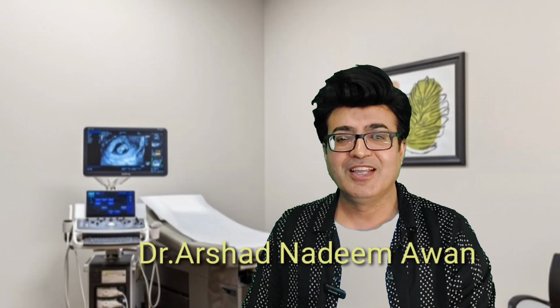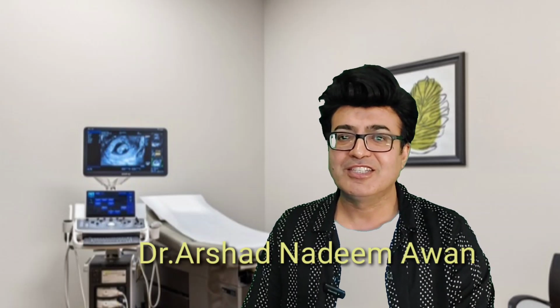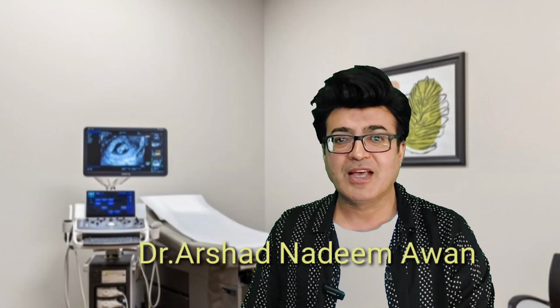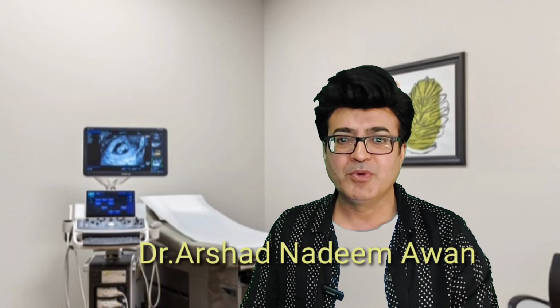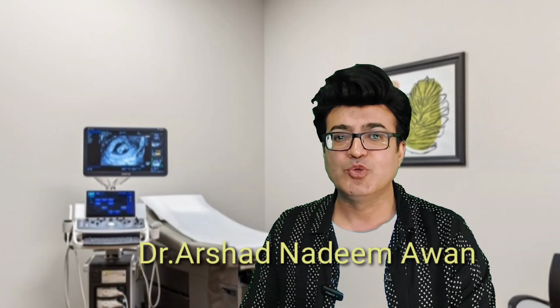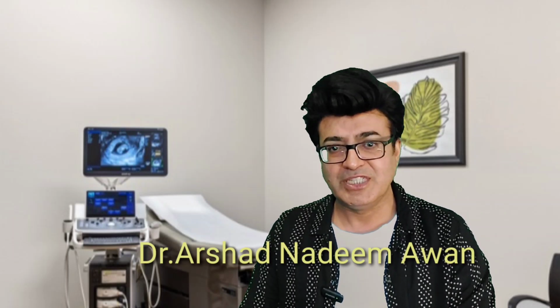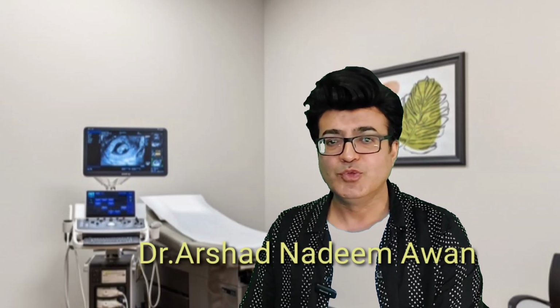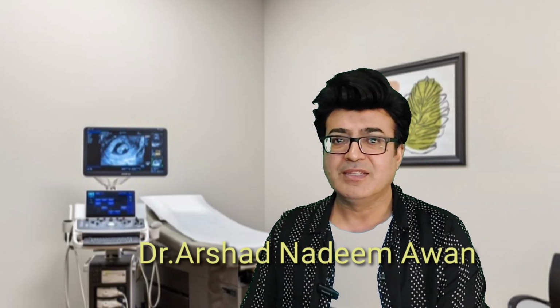Today my topic of discussion is intrauterine contraceptive devices, which is also called IUCD. Many books, many researchers use the term IUD or IUCD. Both are synonyms. Whether you want to use IUCD or IUD, it doesn't make any difference. Intrauterine contraceptive devices are used for two purposes. The one is to control the bleeding, and the second is for contraceptive purposes.